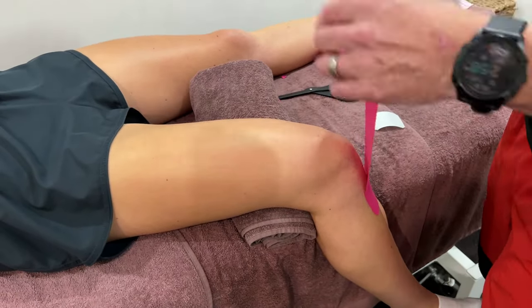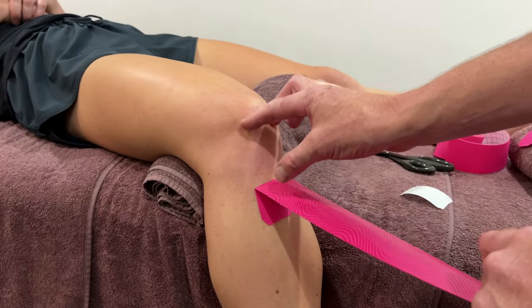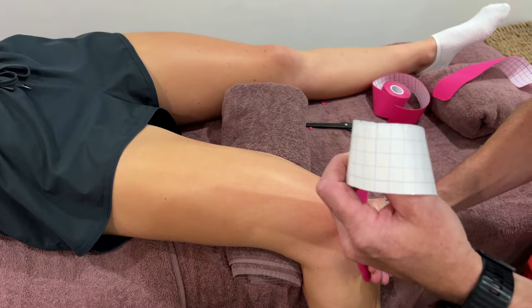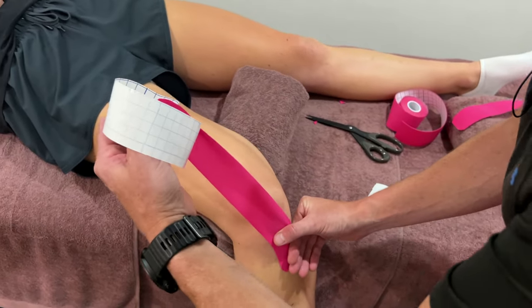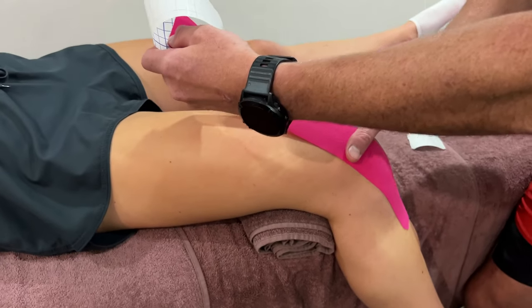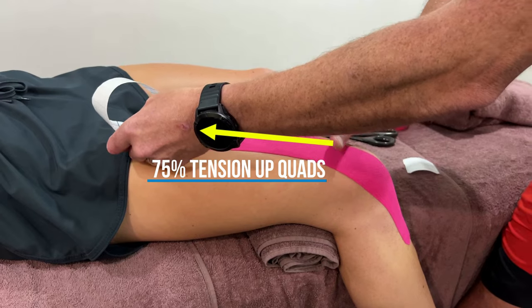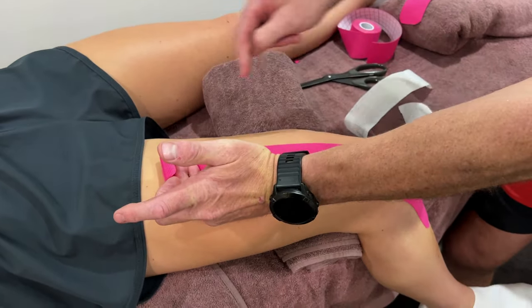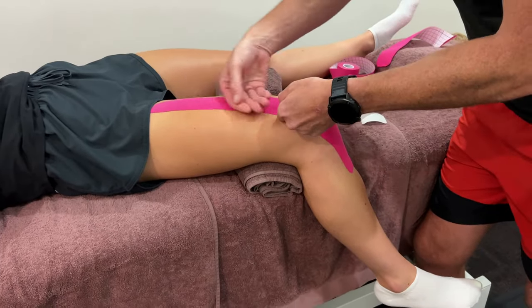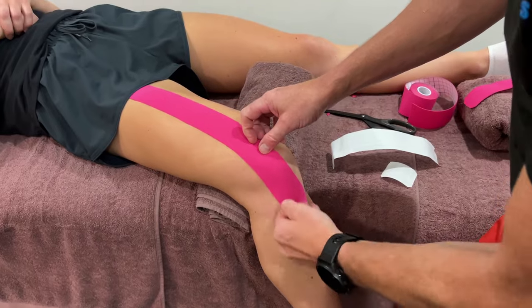From that anchor point, come over that kneecap — not directly over the center, but off to the lateral, going over the top of it. You can do what we call a little round-the-kneecap: come out on an angle with about 50% tension around the kneecap, then come back in line. I'm still mid-line lateral. Then crank it up to about 75% up that quad, keeping in line. The anchor point at the top is zero again — I've gone to here and I can just finish it off. You can go even higher if you want, but I've covered a lot of quad there which is great. We're dealing with this tendon, so that's how far you need to go. Make sure you push all that down.